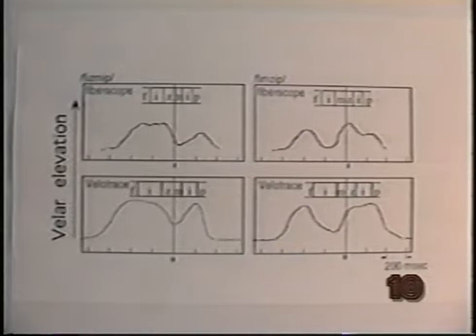Several studies were done to evaluate the velotrace. In one study, we examined the ability of the velotrace to follow rapid downward and upward movements of the velum. Velotrace data were compared with data obtained through frame-by-frame measurements of cine films photographed through a nasally positioned fiber optic endoscope, and some of those data are shown in this figure.